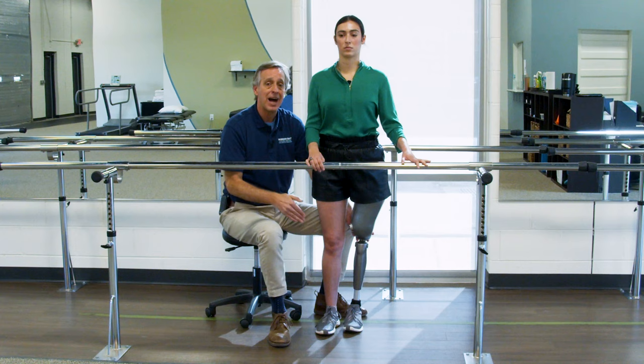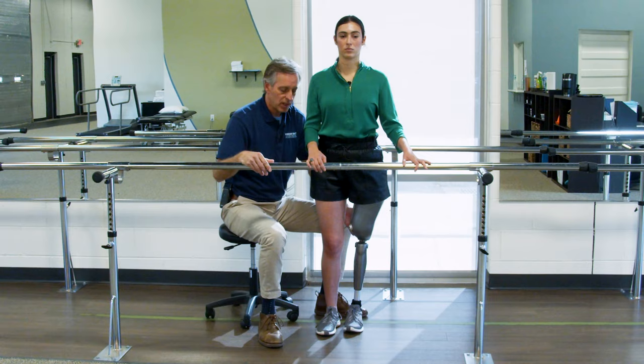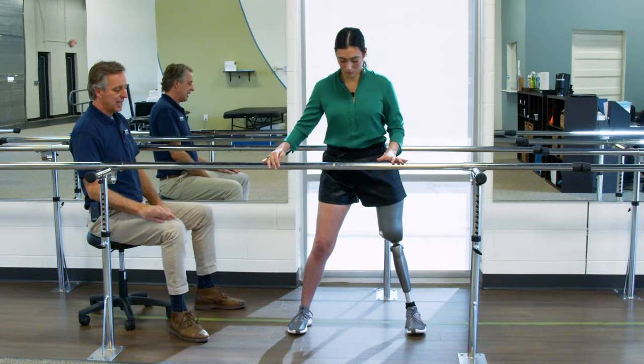Why? Now that leg's really underneath her. Now it's in a power position. If it's out in front, the knee is in a position where it can buckle, and we don't want that. It's not a power position. So I want you to repeat that a few times, sidestep towards me and bring that leg in level or behind. Doesn't have to be that far behind, kind of level or slightly behind your other toes.